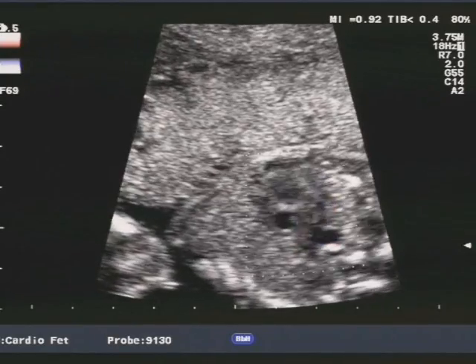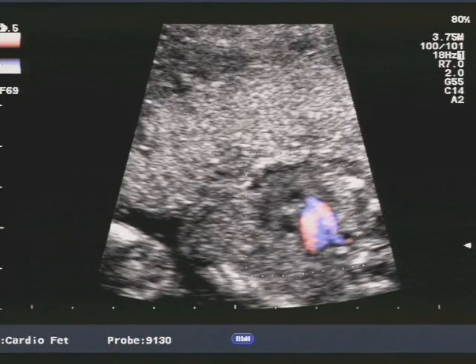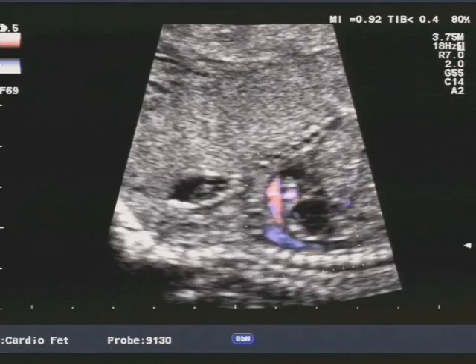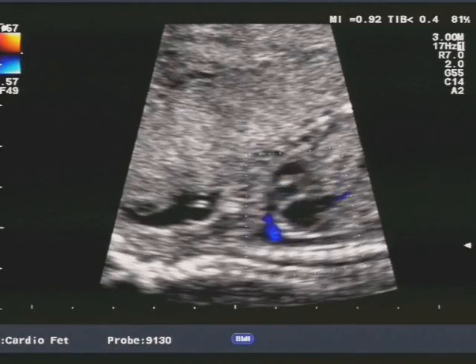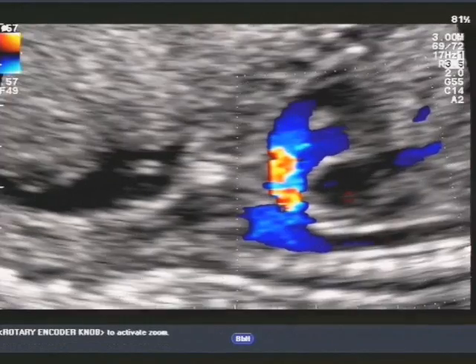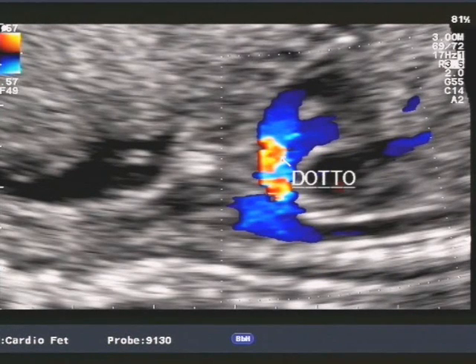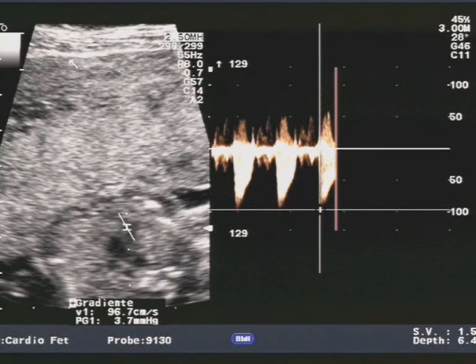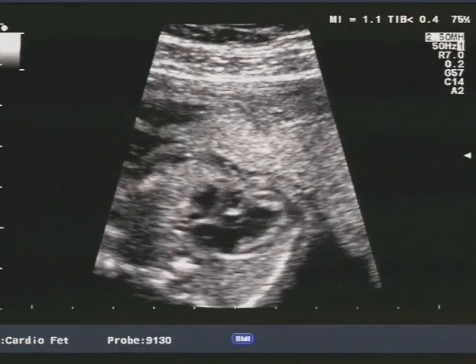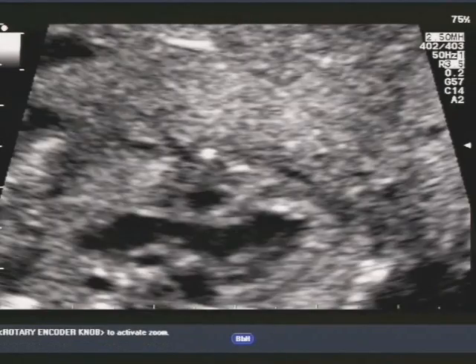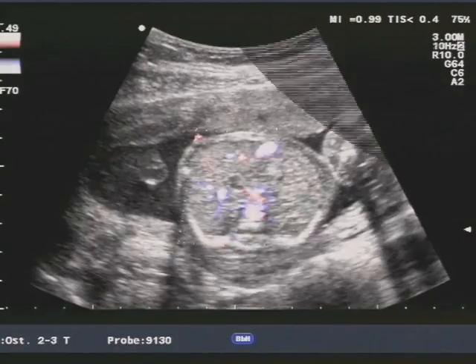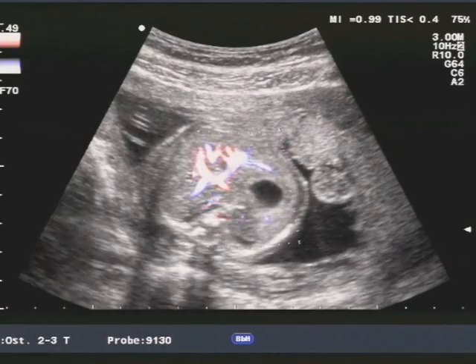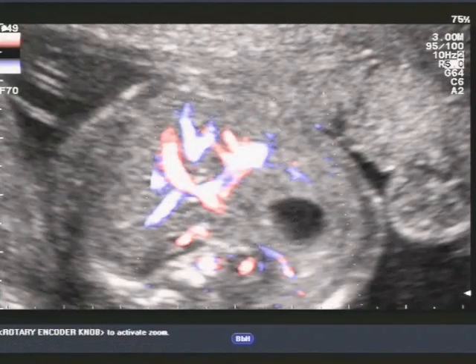Ci si aspetterebbe in questi casi di trovarci di fronte a una patologia importante sia della tricuspide che della polmonare, ma in realtà si tratta di una patologia nella quale si riscontrano certamente delle alterazioni biometriche di dette strutture, ma senza un'alterazione funzionale delle valvole. Le forme classiche di cuore destro ipoplasico sono legate a patologie importanti della valvola tricuspide. Un altro elemento che conferma la riduzione del flusso nell'arteria polmonare è il reverse del flusso ematico attraverso il dotto, dall'arco aortico verso la parte destra del cuore. La velocità massima nell'arteria polmonare è ai limiti alti della norma, di poco sotto i 100 cm al secondo.